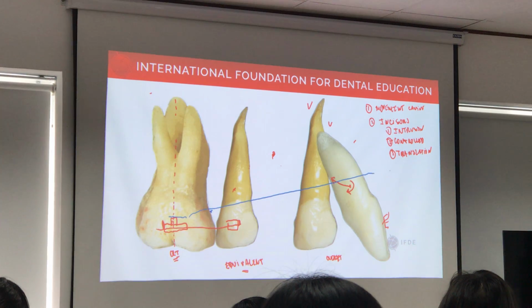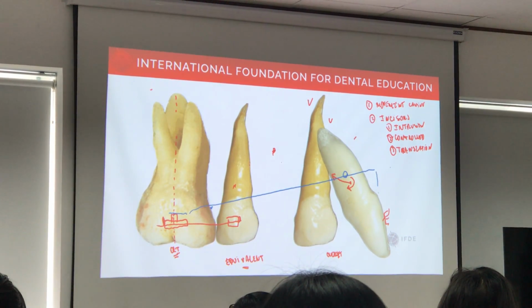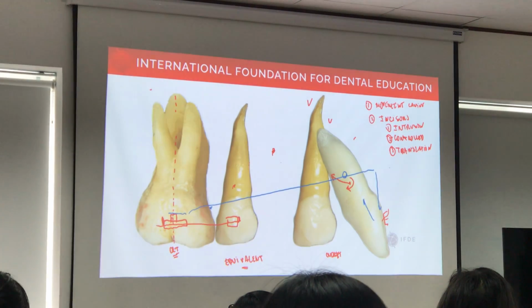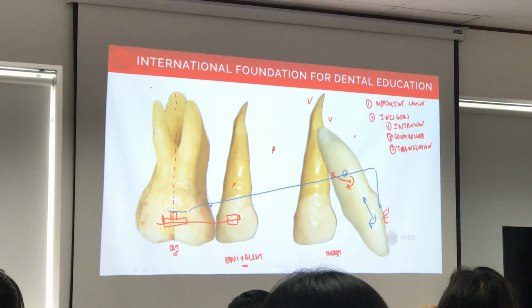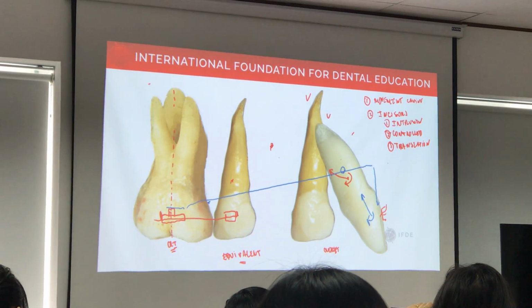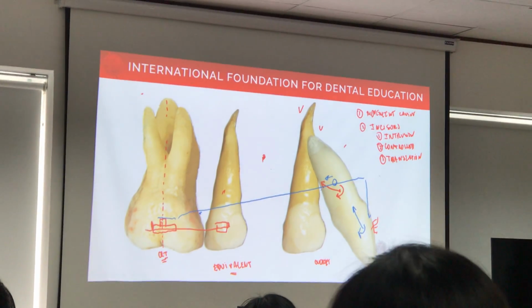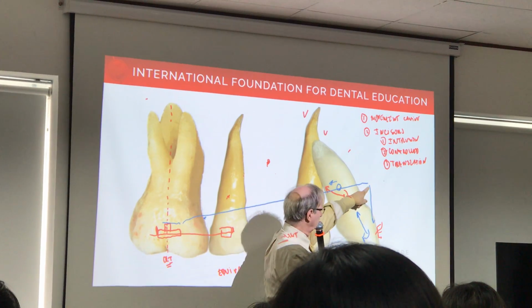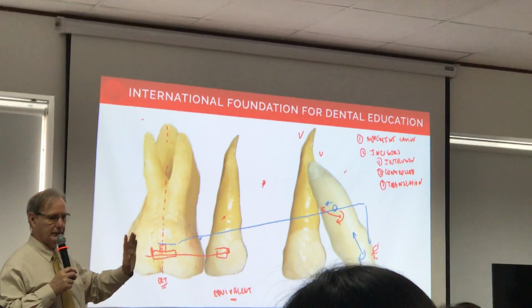Remember that? We did that yesterday. Loop here, and you bring the screws down, and you get probably the right force and the right moment. Okay? And you leave this alone, and you need a small force right here, little F1, remember, elastic. And this system will allow you, very simply, if you put a force here, what happens there? There's no free lunch again.